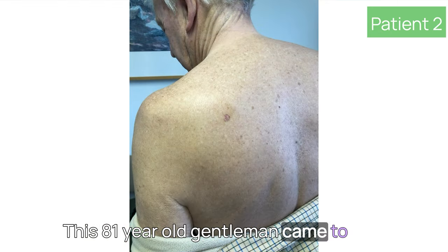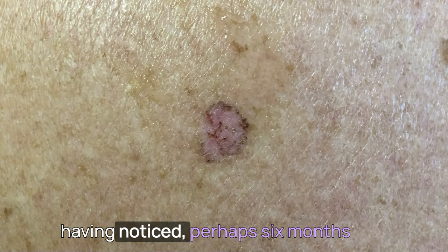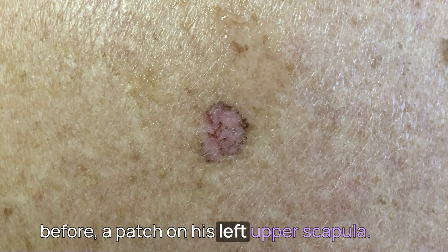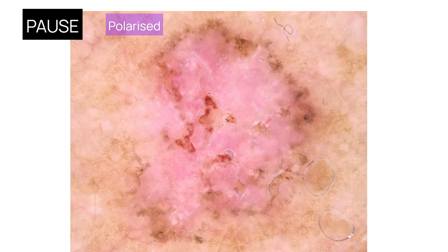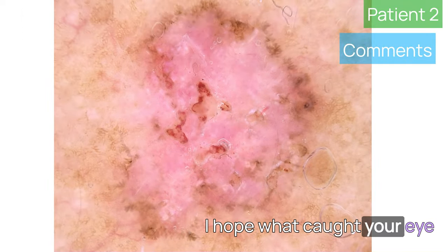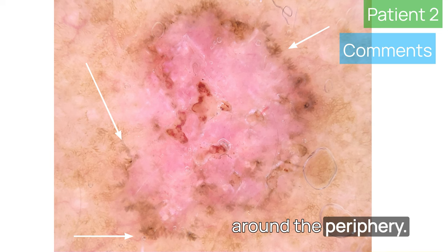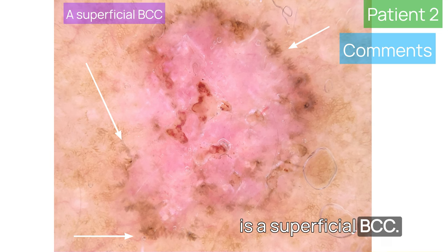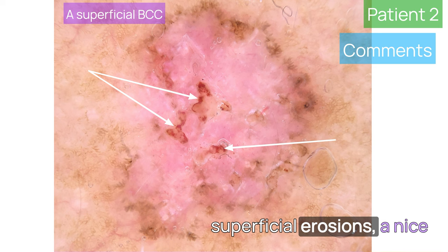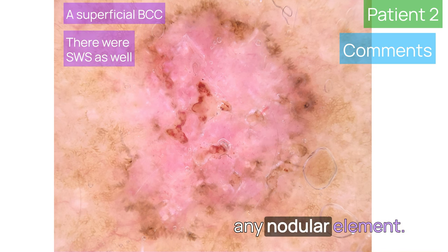This 81-year-old gentleman came to me having had a previous nodular BCC, having noticed a patch on his left upper scapula about six months before. What caught your eye should be the most wonderful leaf-like structures around the periphery — this means it is a superficial BCC. This is confirmed with the superficial erosions, a nice homogenous pink background, and no structures suggesting any nodular element.